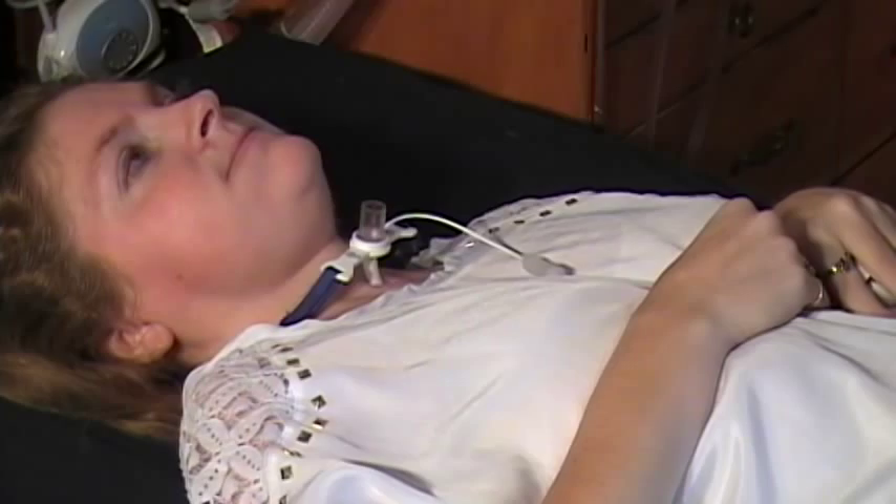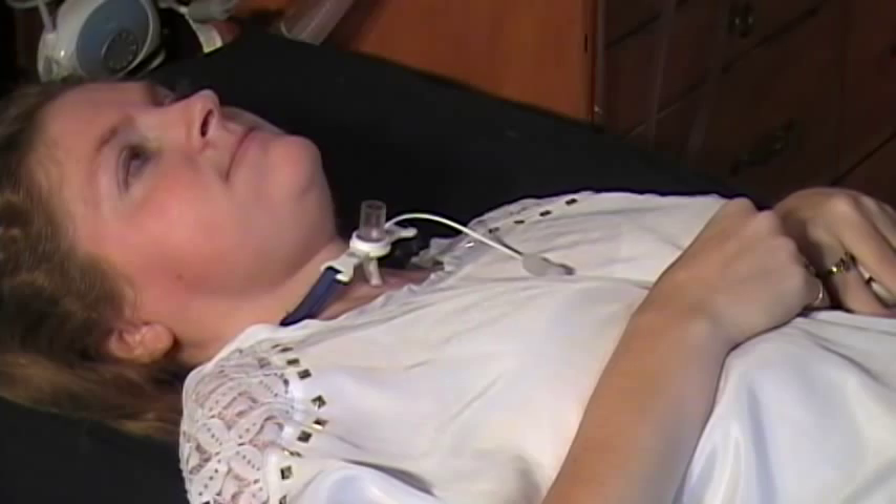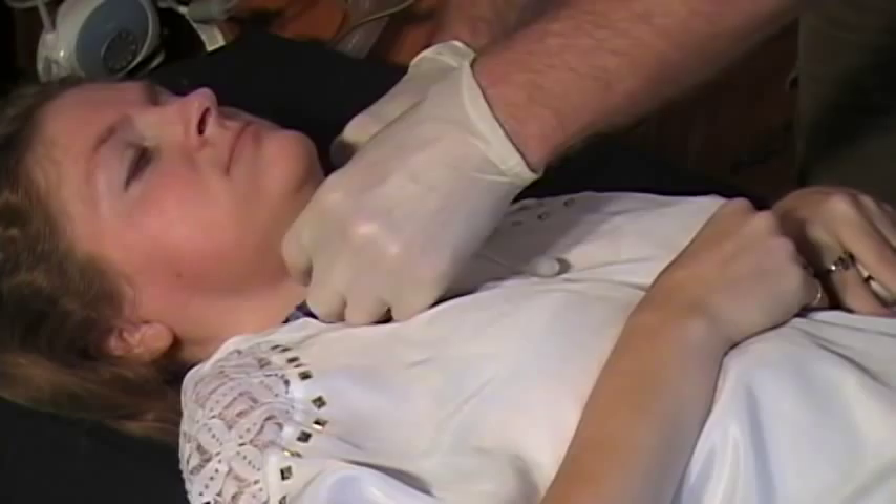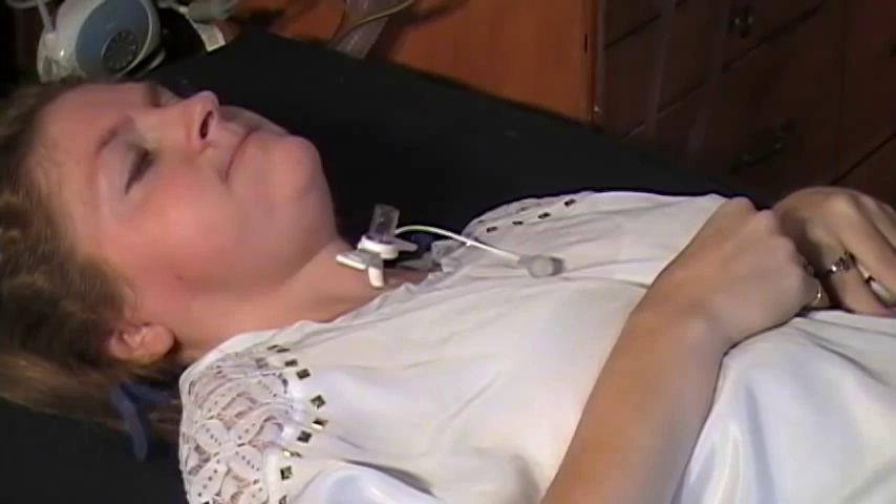Next, I'm evacuating the water from the cuff, which is still inside her trachea. And now I'm disconnecting the trach collar. I use a soft Kleenex to help grab any excess mucus that likes to come out when I withdraw the tube.